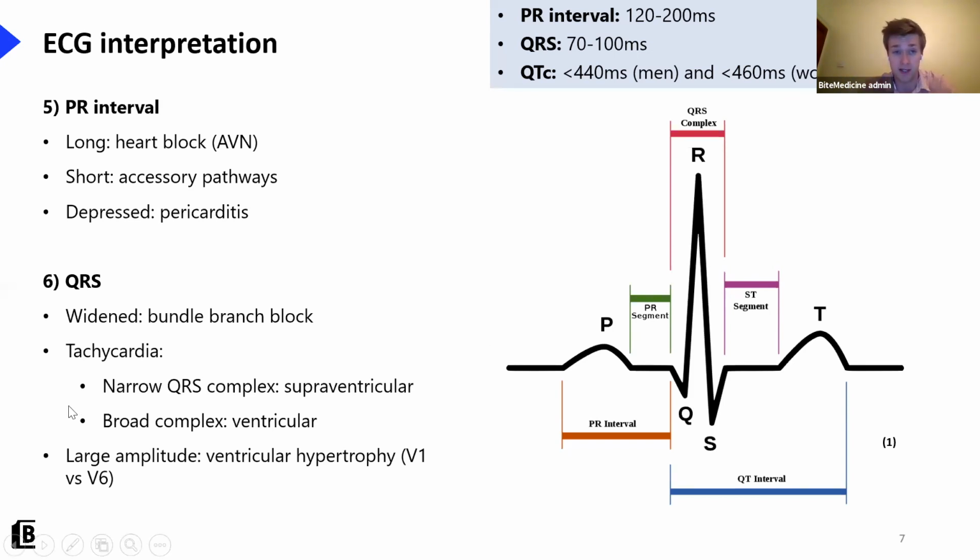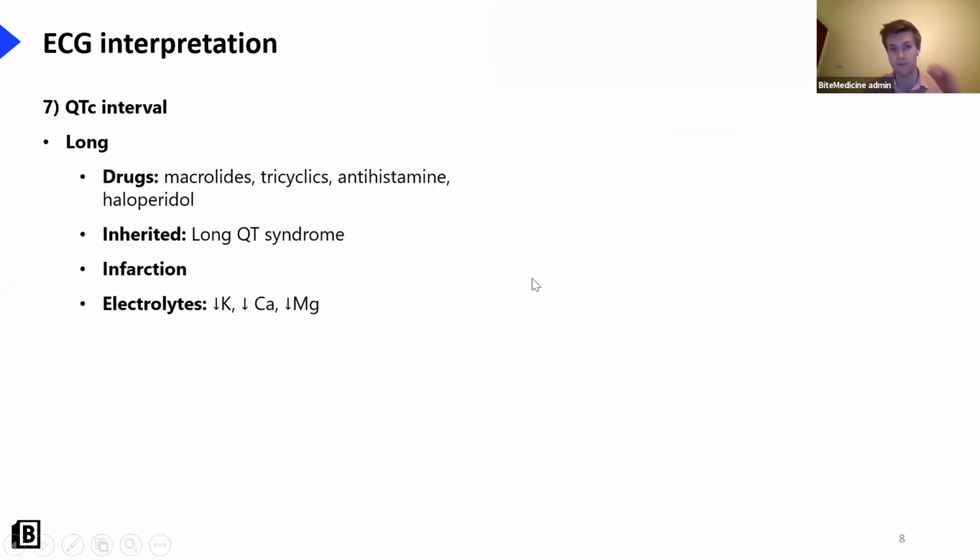And when it comes to tachycardias, as you'll see in today's session, commenting on broad versus narrow QRSs is absolutely essential to management. And finally, commenting on their amplitude is really important, as it can indicate too much ventricular muscle, which is why you therefore have more electrical activity. So I hope this is ringing some bells for those who attended last time.